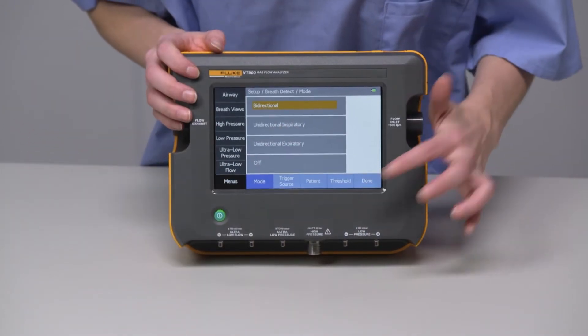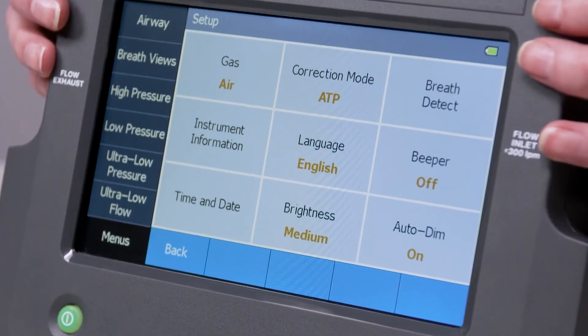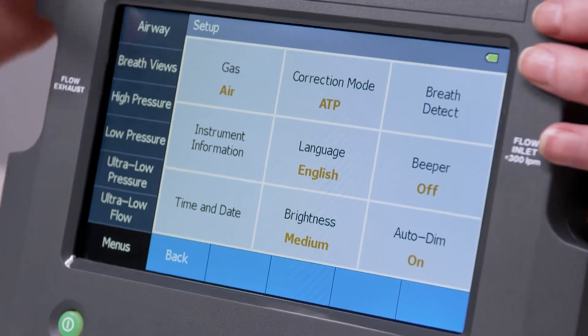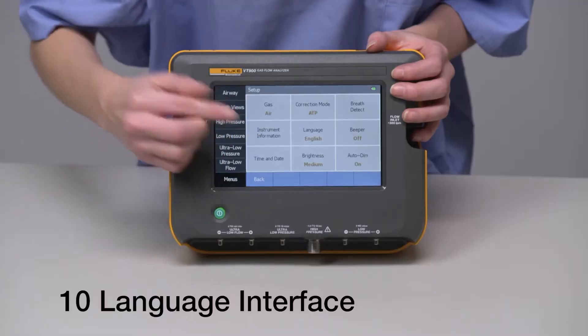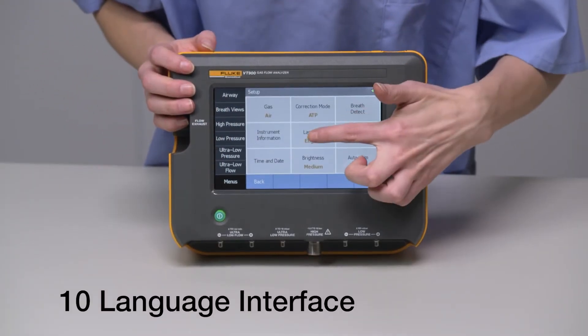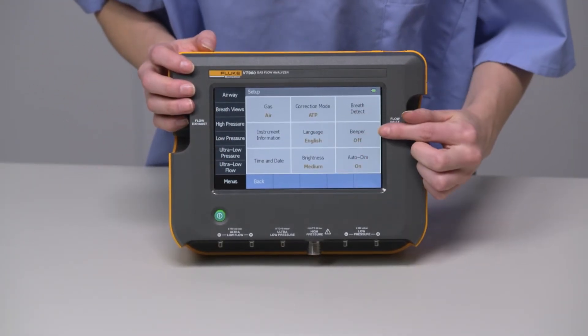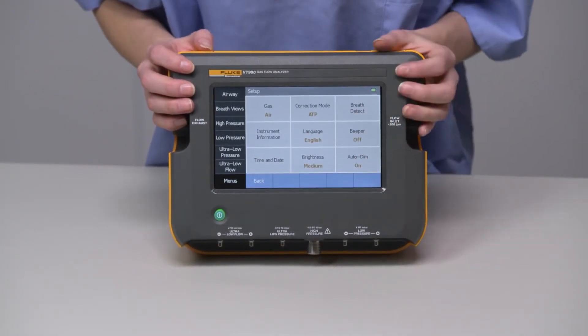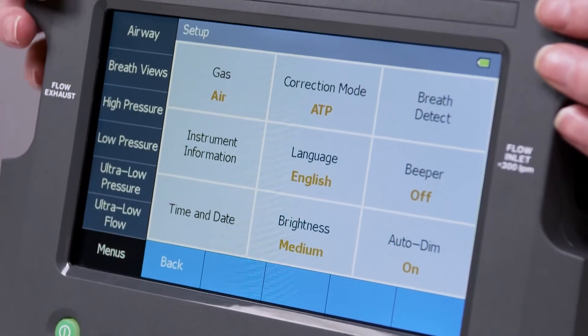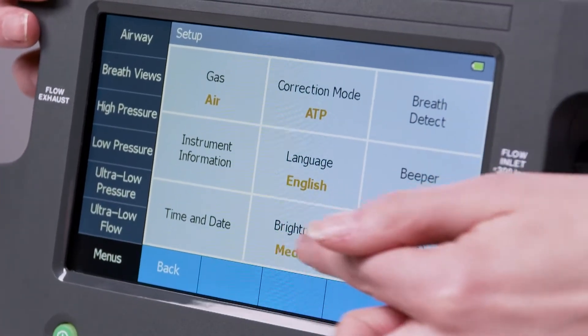Back in the Setup menu, you'll also find your instrument information settings, sound, time and date, and brightness settings.